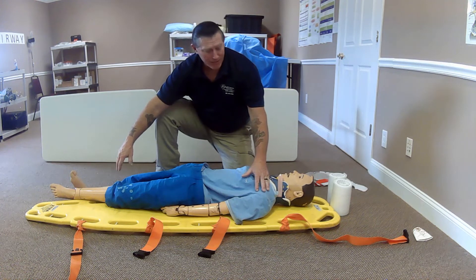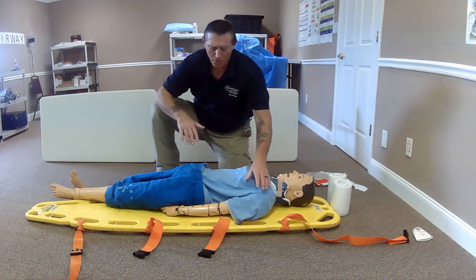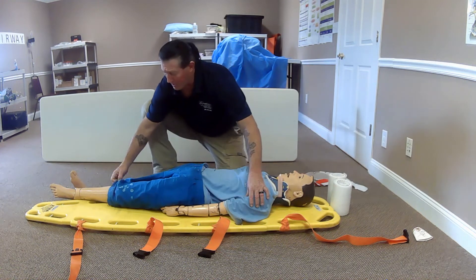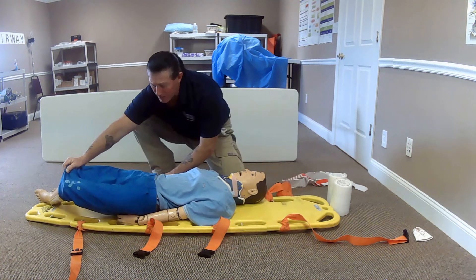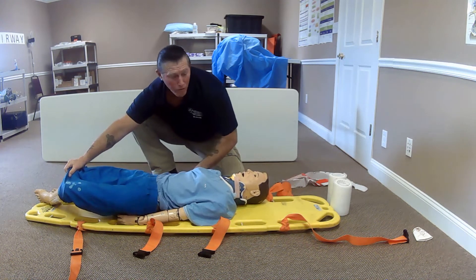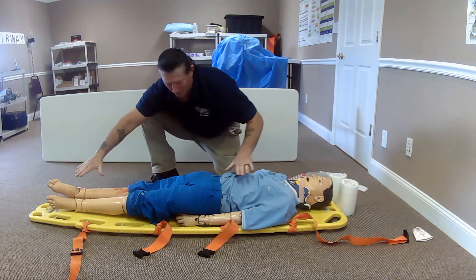Assuming I've got an EMT assistant at the feet and one at the head, I'm central. On the count of three, with the assistant, we're going to come down — one, two, three — and then up — one, two, three. We will simulate these adjustments on the board.